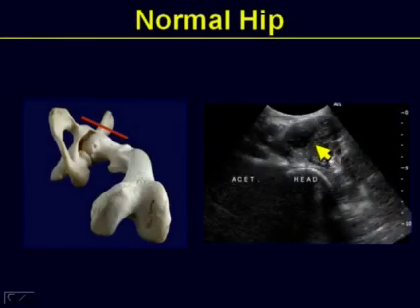It is not uncommon for us to turn slightly oblique in order to elongate the runway or the perspective of the femoral neck. As a matter of fact, when we do interventional approaches to the hip, we like this type of approach because it lengthens the runway, and so our target's a bit longer. So aside from a strict short axis view, as you can see on the right hand side, try to remember that you can also slightly oblique the transducer in order to accentuate any or all parts of the subcapital portion of the hip.